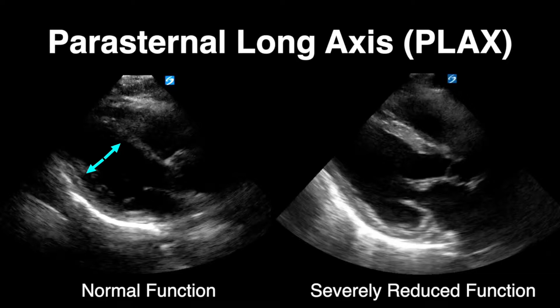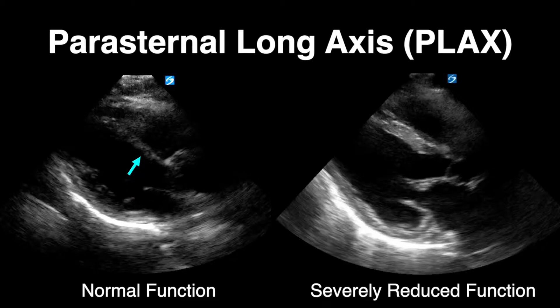In the parasternal long axis I mostly focus on the left ventricle. We identify the myocardial wall and pay attention to how much it comes together during systole. Another trick is to look at the anterior mitral valve leaflet and how well it approximates the septal wall. If it's hitting up against the septal wall during initial filling, the ejection fraction is likely in the normal range. This can be difficult to interpret in patients with arrhythmia, tachycardia, mitral stenosis, or aortic valve regurgitation.